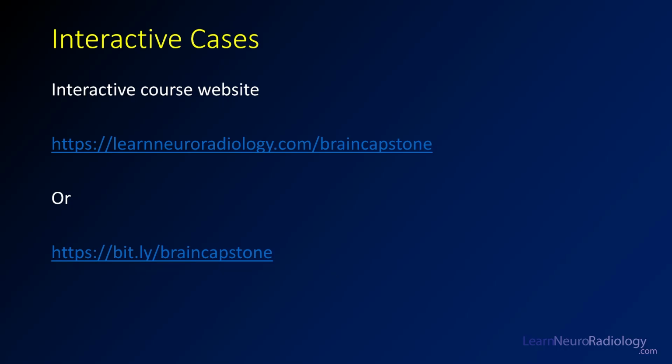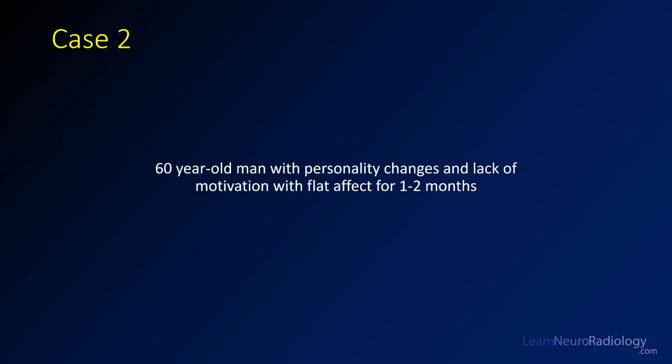But now we're going to go ahead and get started with the case. So case number 2 is going to be a 60-year-old man who's having personality changes, lack of motivation, and a flat affect for the past couple of months. So without further ado, let's take a look at the images.